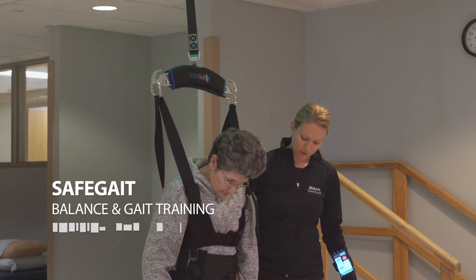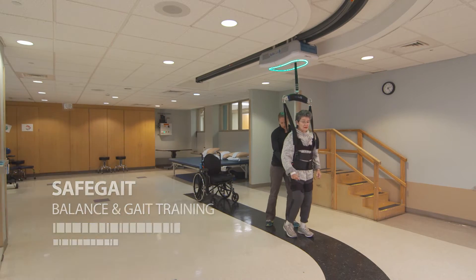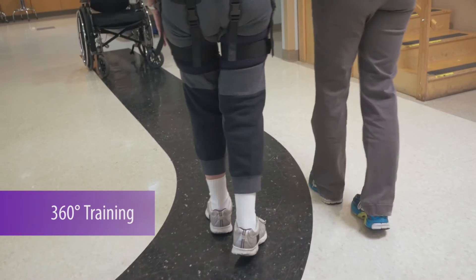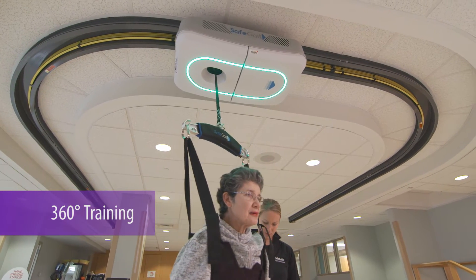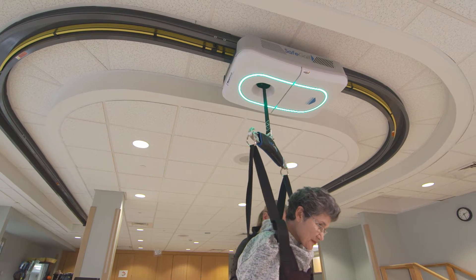The Gorbel Medical SafeGait is a dynamic weight support system used for balance and gait training. SafeGait is a 360-degree balance and mobility trainer designed to help Moss Rehab patients walk again after a stroke, spinal cord injury, multiple sclerosis, amputation, and other neurological or neurodegenerative diagnoses.